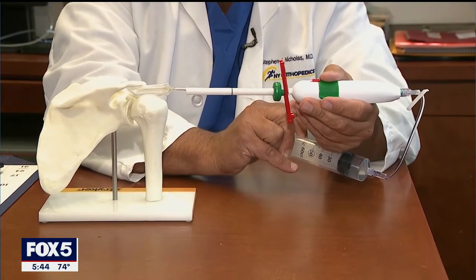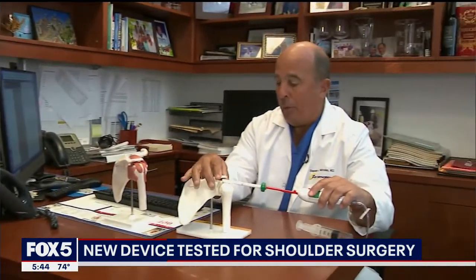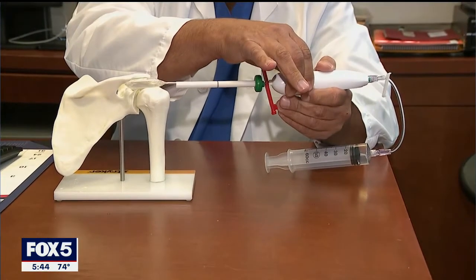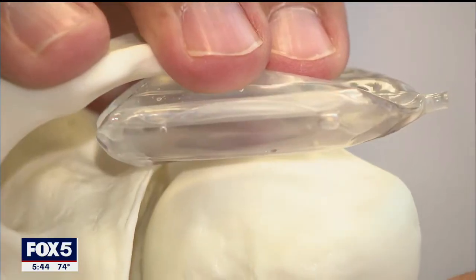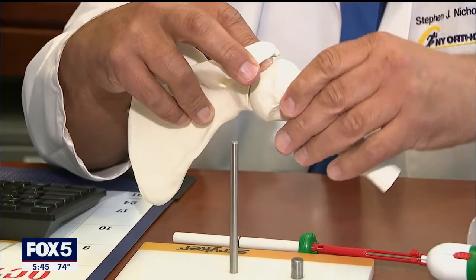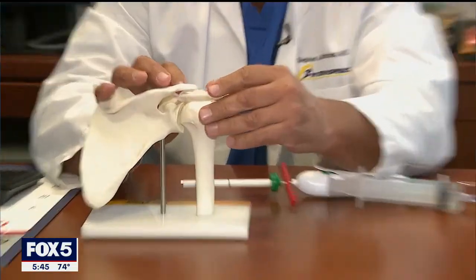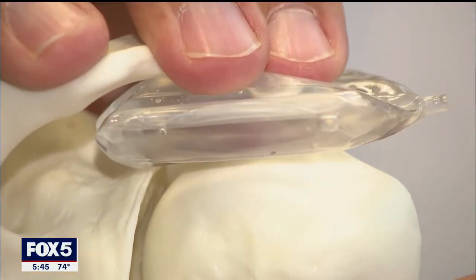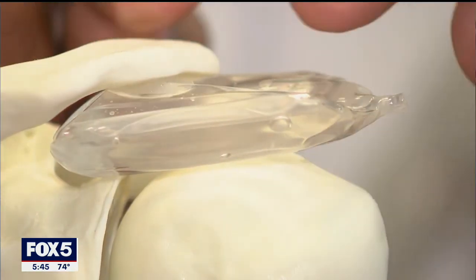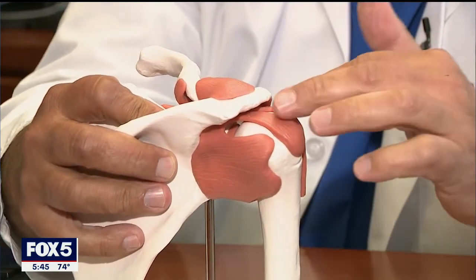We fill the balloon so it encompasses that whole space. New York Orthopedics' founder and director, Dr. Stephen Nicholas, shows us a new FDA-approved medical device and technique being used to repair torn rotator cuffs. He demonstrates how the saline balloon is inserted into the shoulder joint. This stops the top and bottom shoulder bones from rubbing together and causing a patient pain. It sits here under the bone and acts as a strut to hold down the humeral head. The Stryker in-space balloon implant dissolves over time.